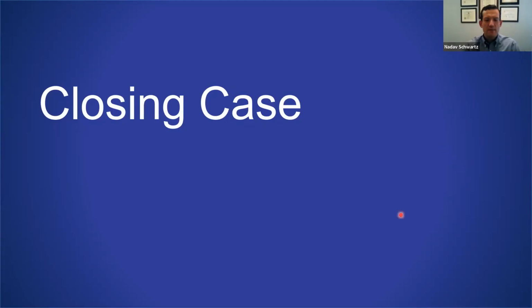Thank you so much. Great job, Matt and Christina. So that was a great overview of normal and abnormal, and hopefully everybody is more than just convinced of the utility of the 3-vessel view to really provide tons of insight into your cardiac anatomy and anomalies, and increase your detection rate for screening for anomalies. But then also, once there's something off, having a better understanding of the relationships of the vessels and how to help decipher what's going on. So there's both screening and diagnostic utility to the 3-vessel and 3-vessel trachea views.